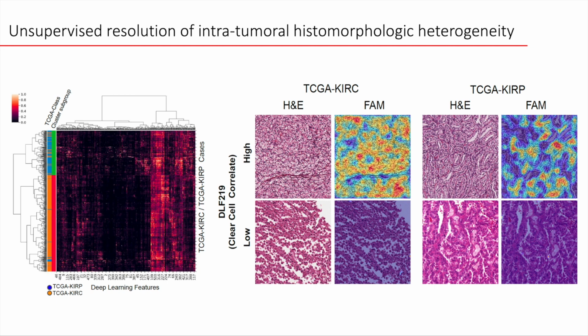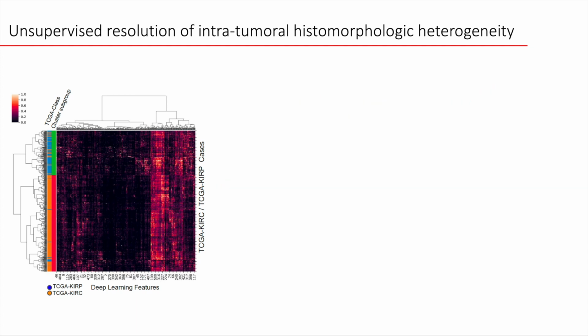It's a clear cell papillary renal cell carcinoma, a newly defined entity with a good outcome. And you can see that when we go low on this feature, again, you get your typical papillary structures that are much more eosinophilic. So these features are completely portable. You can use them in different tissue types, and again, provide not only transparency, but also histotype quantitative tools for digital and cellular pathology.